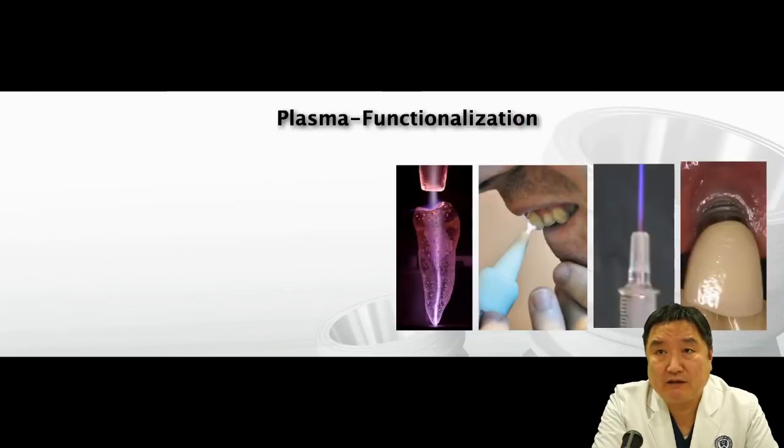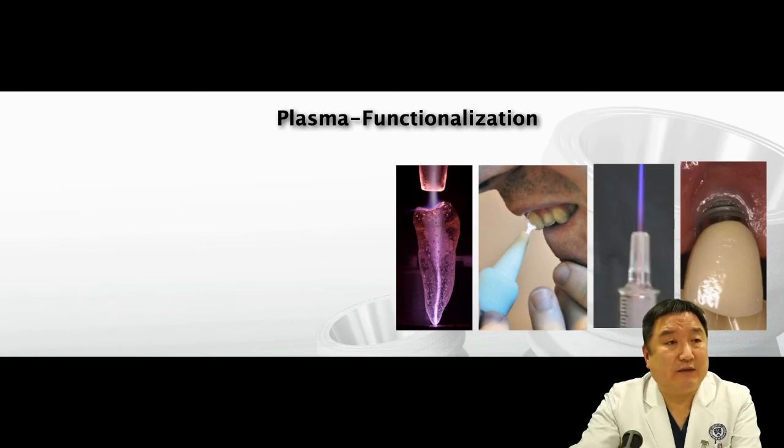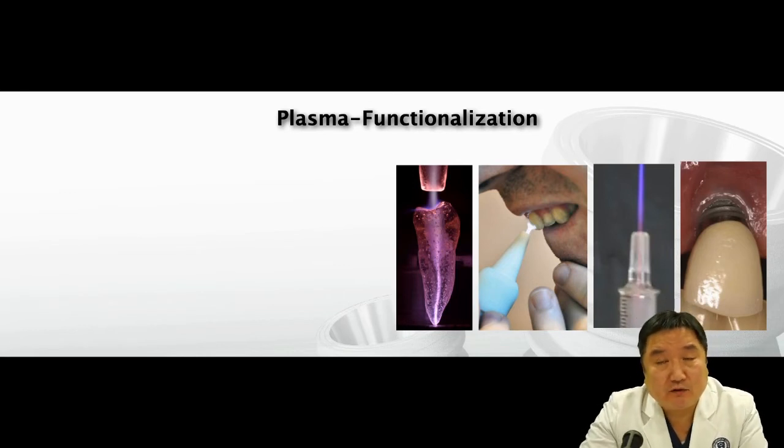This non-thermal plasma has several advantages. If you use it in a dental use, it can be used in the patient's mouth to remove the plaque, and you can also use it for endodontic sterilization, and even to expose the implant surface due to bone loss around the implant by peri-implantitis. It doesn't cause any kind of heat, so for dental use there will be a lot of advantages that we can take for the dental treatment.